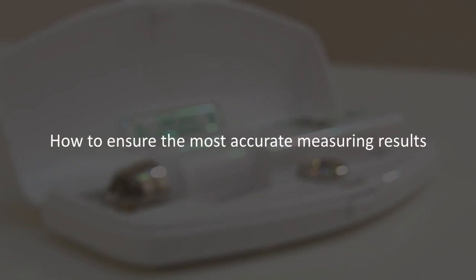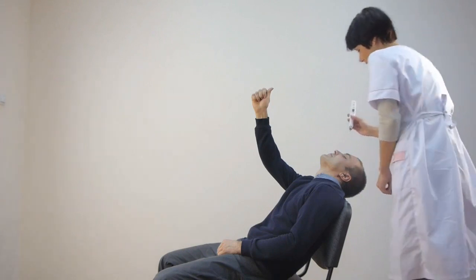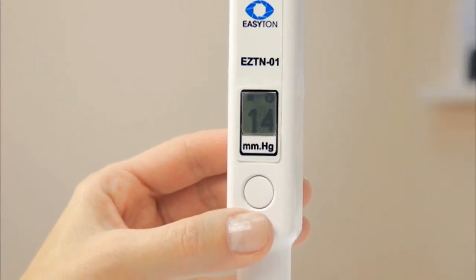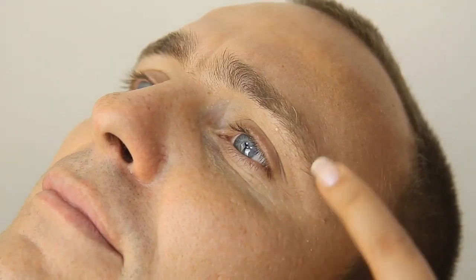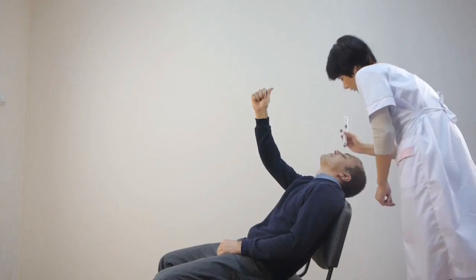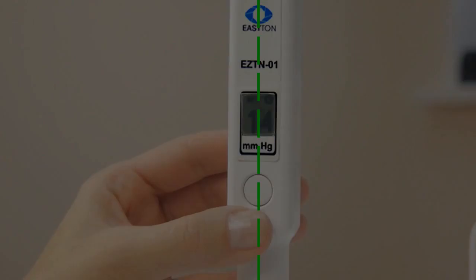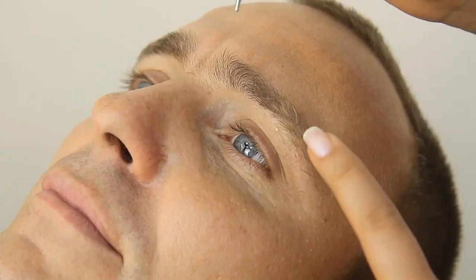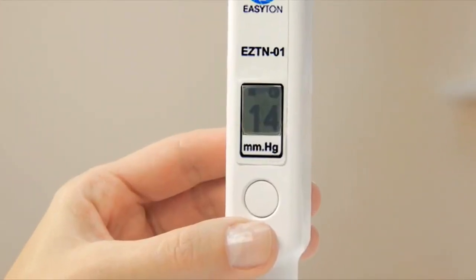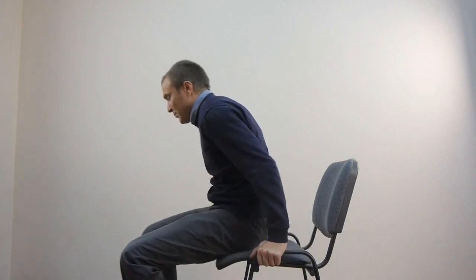Follow these simple rules to achieve precise measurements: ensure a proper grip and gliding movements of the tonometer. Provide support for the hand to make your own movements more precise. The patient's gaze must be fixed at the test object. Place the tonometer strictly upright. Stretch the eyelid smooth, avoiding any folds. Place the tonometer rod properly and make sure it doesn't shift along the eyelid surface. The proper patient's position is ensured.